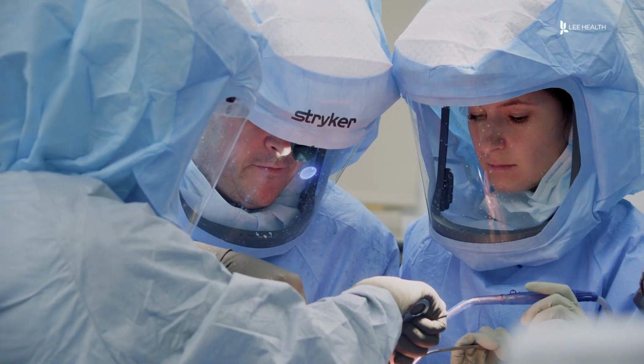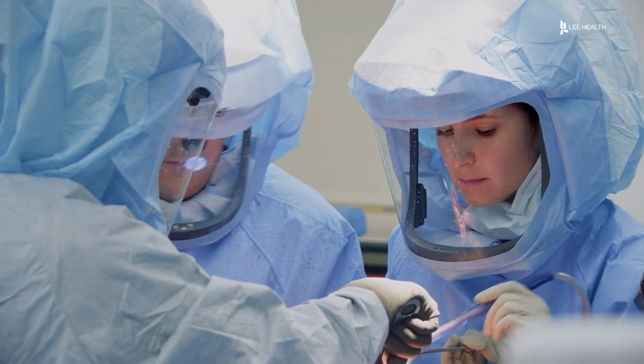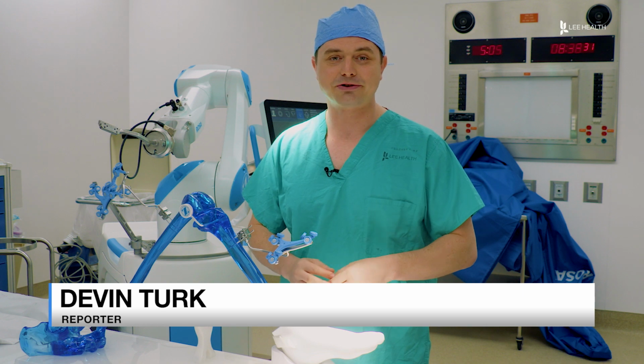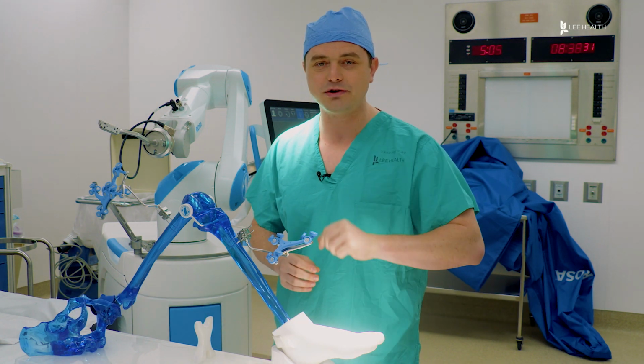A lot of the surgeries still, me and the assistants and my hands and that sort of thing operating the tools. And this is more of kind of an extra assistant that kind of helps guide where everything needs to be. The biggest advantage of the ROSA machine is the accuracy and precision. Doctors can make changes of up to 0.5 millimeter in real time.